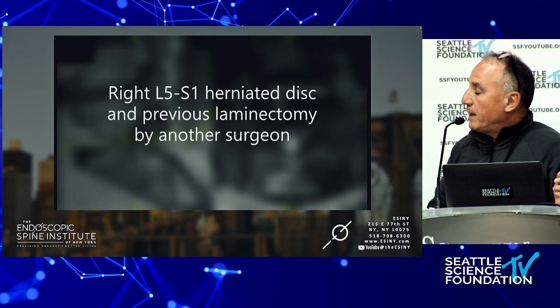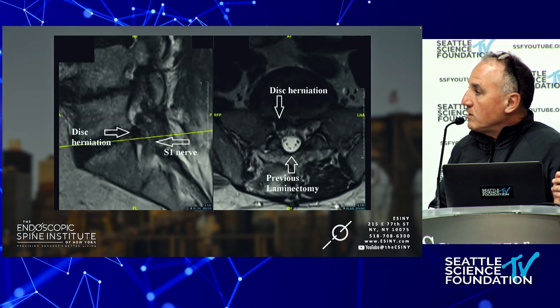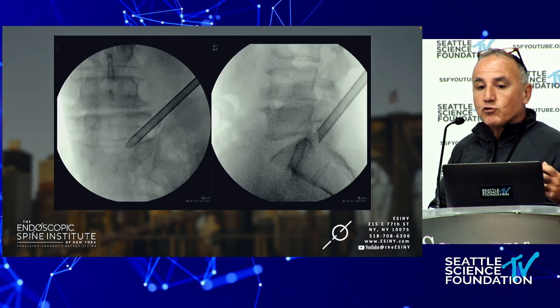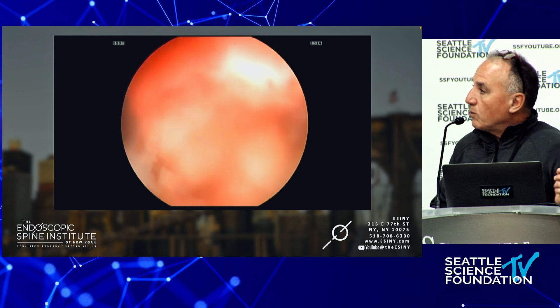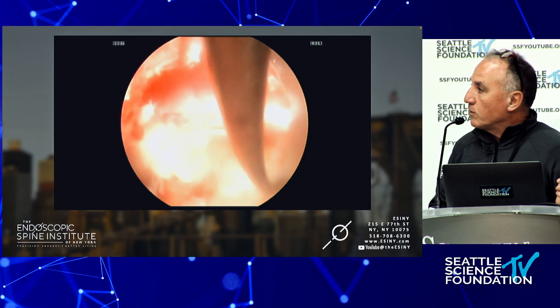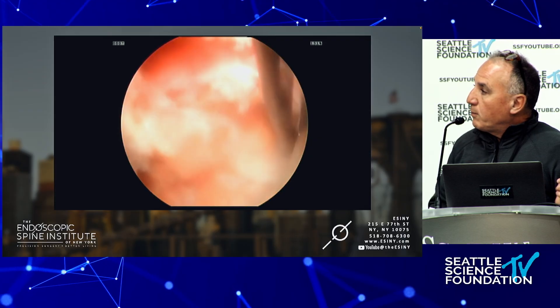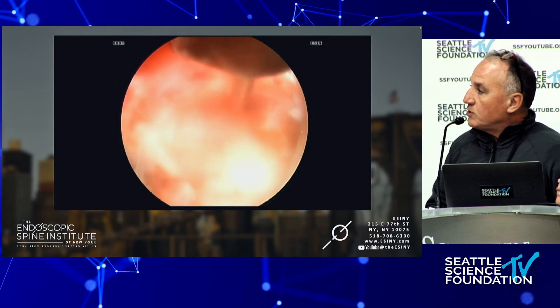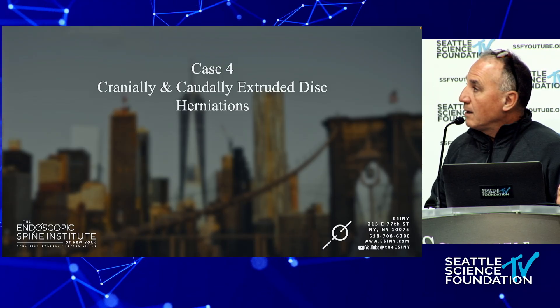Disc re-herniation: this patient had a laminectomy at Harvard and now has a disc herniation. This is one of the superpowers of transforaminal endoscopic spine surgery, because you're going through virgin territory. Here is a terrible disc herniation sitting underneath the S1 nerve root — this patient sends me so many referrals. I put a ball probe underneath the S1 nerve root, break up that scar tissue to free the disc herniation, and then remove this large chunk of disc.